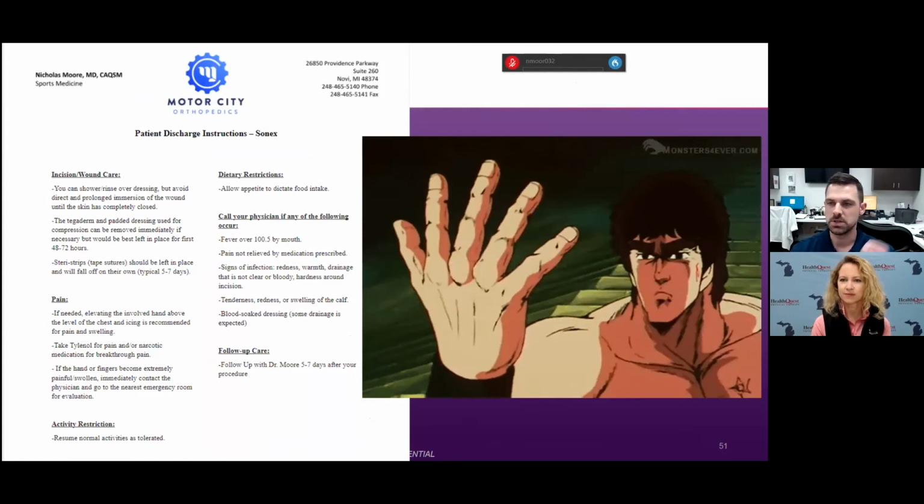You might have to play with the extension in the wrist, or, if the anatomy is really tight, you might have to lean the device toward the ulnar wrist so that you're out of the direction of the median nerve. And there are little tricks of the trade that I'm picking up the more you do it, but it's the same end game as releasing the ligament.